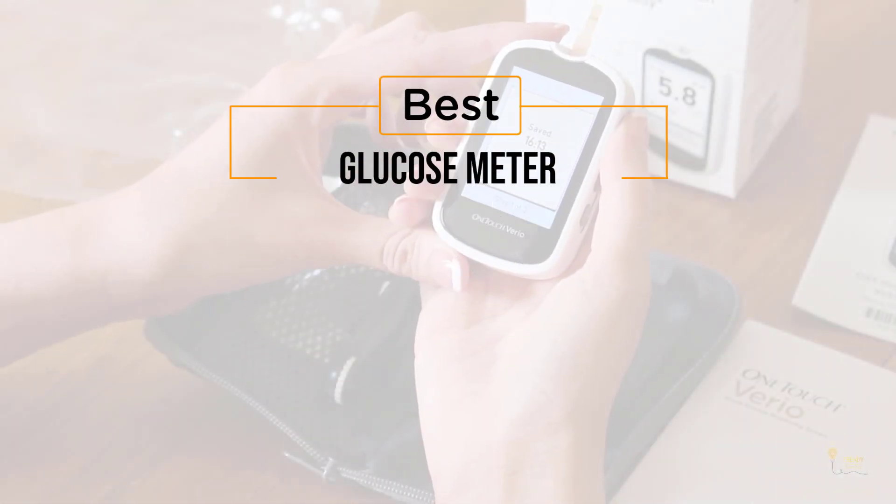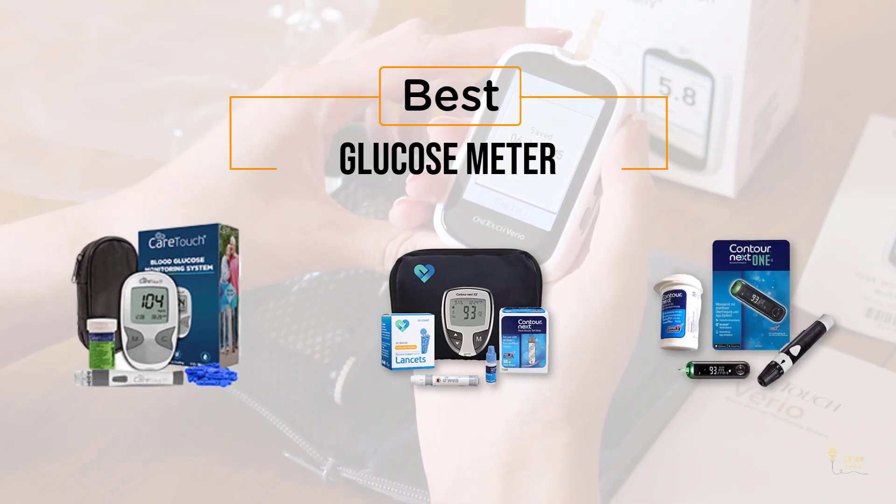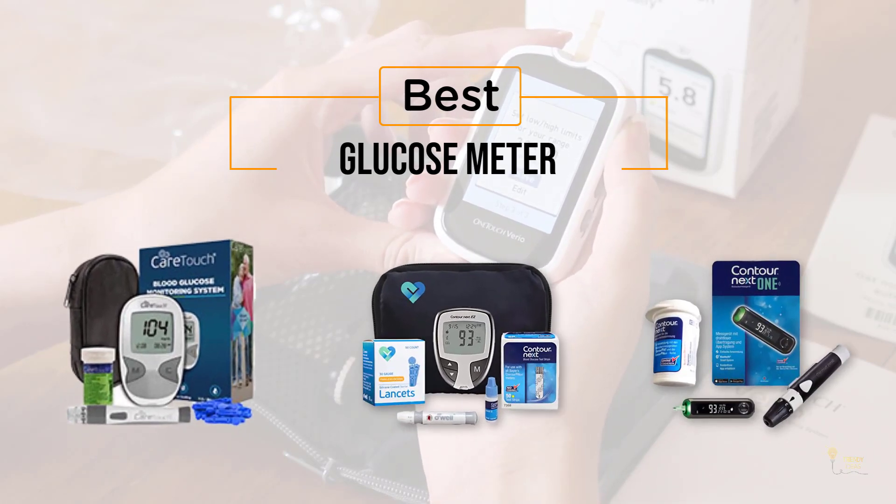If you're looking for the best glucose meter, here's a collection that you've got to see. Let's get started. At any time you can click the circle for more info and real-time deals.